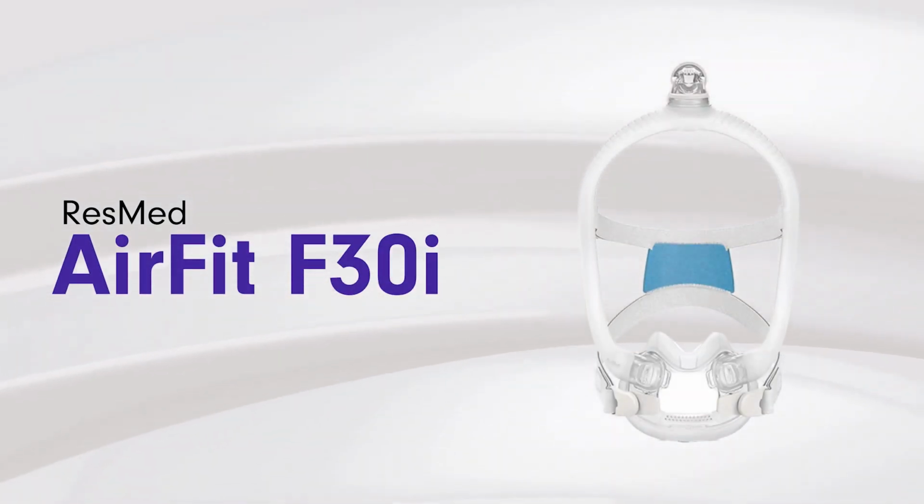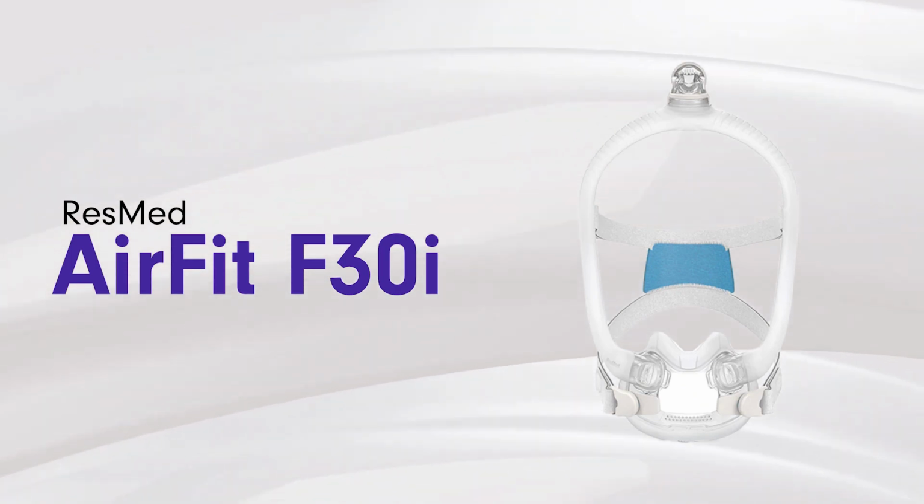For those, I think we have the AirFit F30 and the AirFit F30i. The difference is one has the tubing on the top of the head and one has the tubing in the front. And there's also the Dreamwear full face mask, which also comes under the nose. So that would take care of that issue with the rubbing on the bridge. That's an option that you can use, okay?